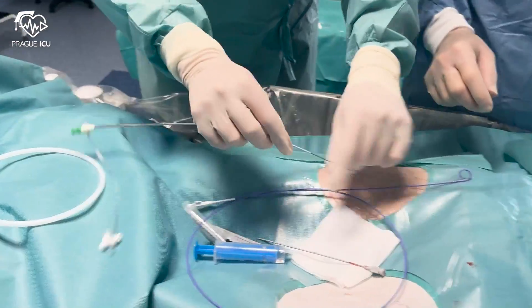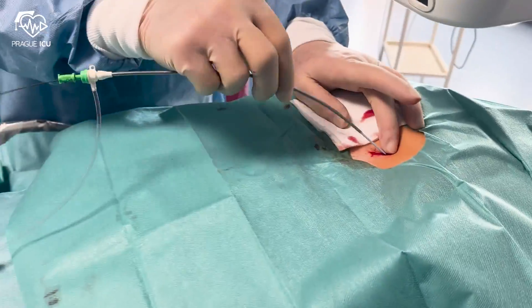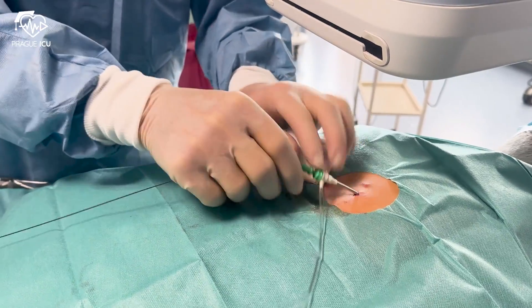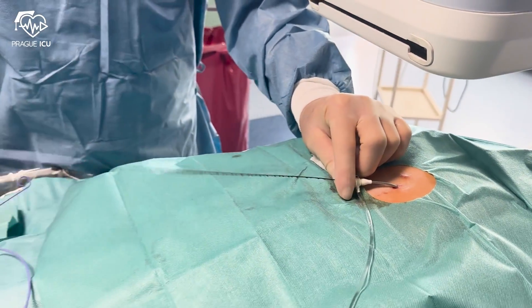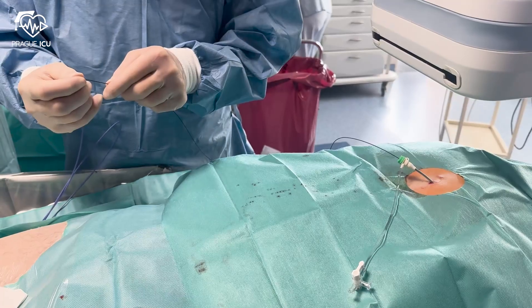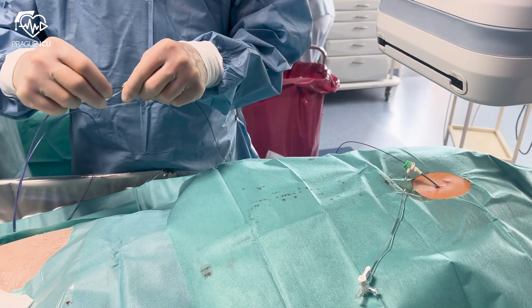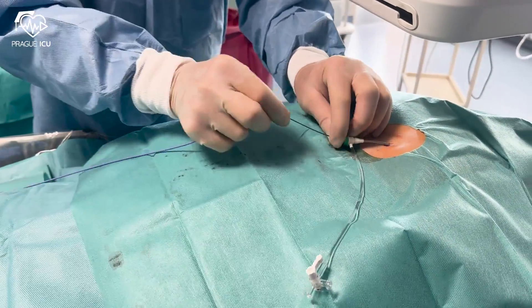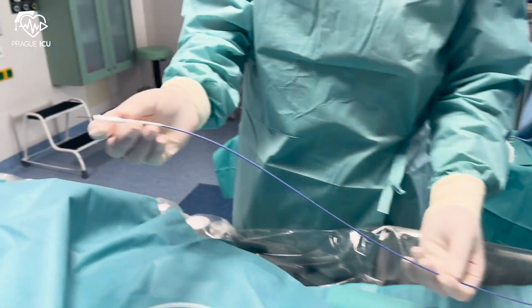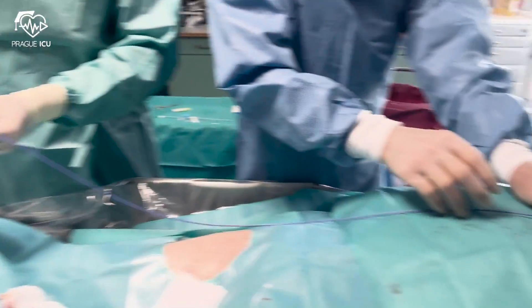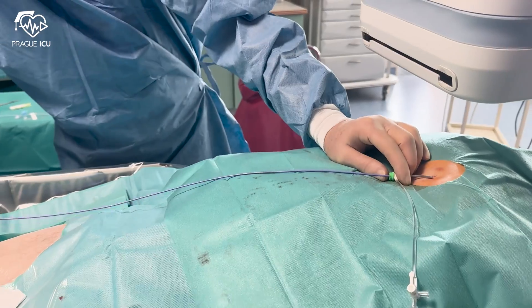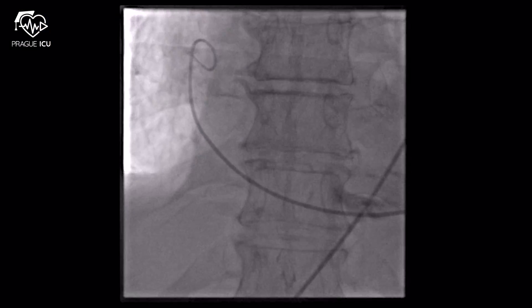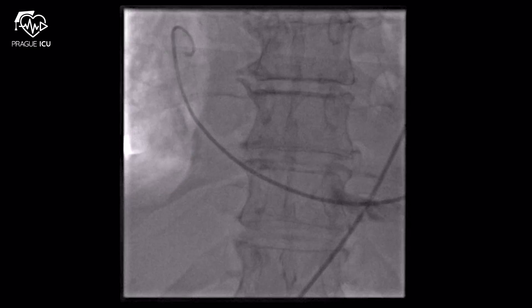Insert the metallic sheath with an introducer over the wire into the pericardial space. Withdraw the introducer and advance the pigtail catheter over the guide wire. Inserting a metallic sheath may be helpful in situations when a pigtail catheter gets clotted in the ICU — you can still use the side port of the sheath for suction. Confirm the pigtail's final position by fluoroscopy.